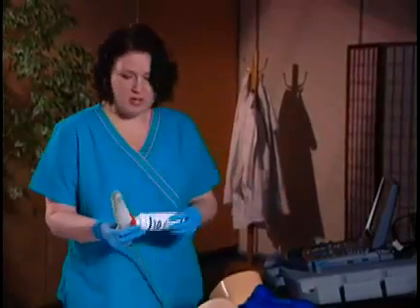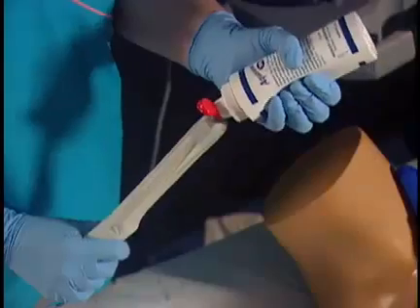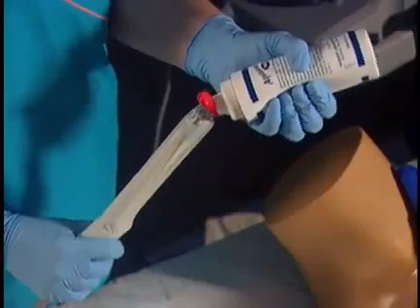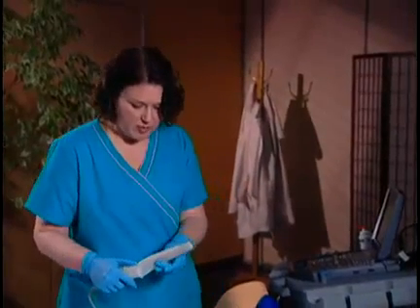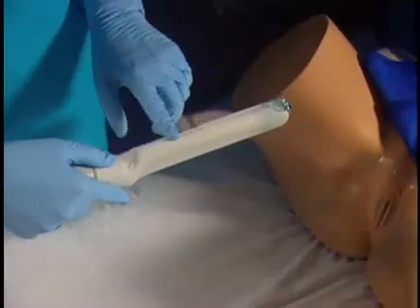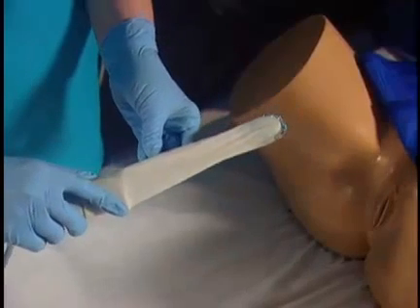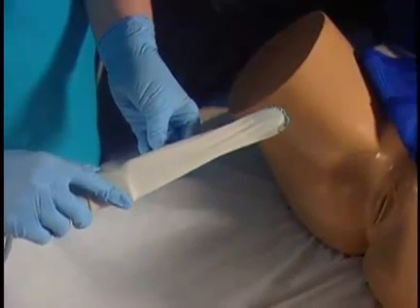Once air bubbles are eliminated, put a little bit of gel on the outside of the latex cover. Orientation is very important: for the long axis or sagittal view, we want the orientation marker pointing up. When we go to the coronal view, we turn it so it faces the patient's right.